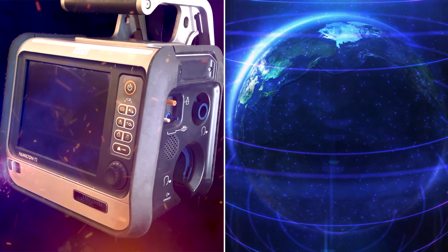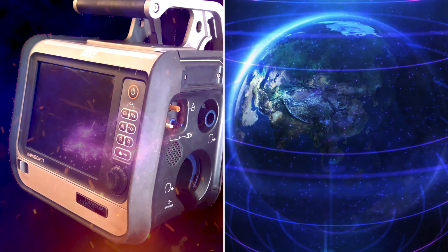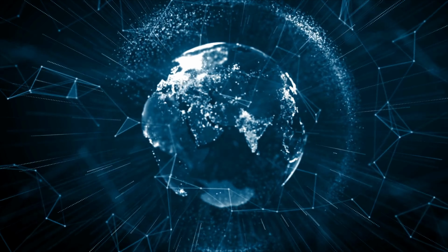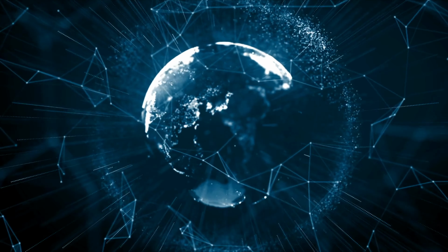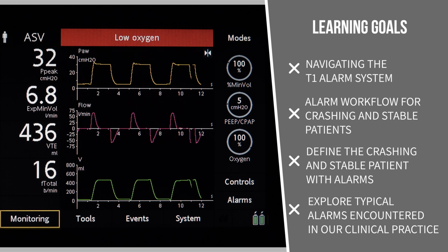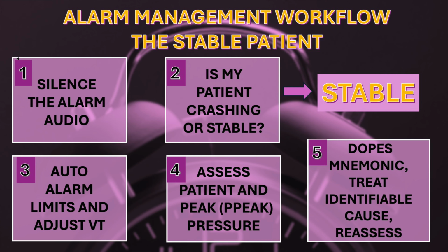Since entering service, the T1 has garnered worldwide recognition as a trusted pre-hospital ventilator. Healthcare providers across the globe appreciate its advanced capabilities, although occasional alarms may still arise as part of its operational features. This module will explore typical alarms encountered in our clinical practice. By applying the alarm management workflow presented in this course, you will develop the knowledge and skills to troubleshoot any alarm situation with confidence and accuracy.